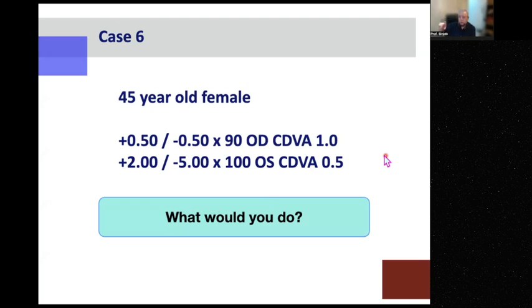And of course, you are going to affect the inferior segment of the stem cells because the spot of UV light will come on them, but no problem because we still have about 320 degrees of intact stem cells. So always do cross-linking even if you are planning to do anything else. Okay.